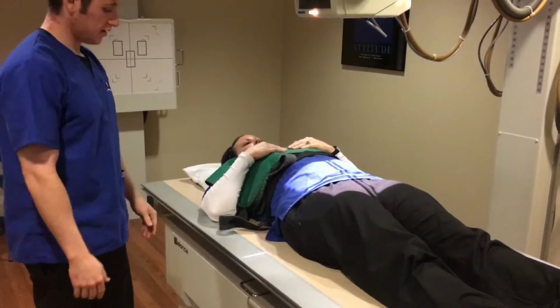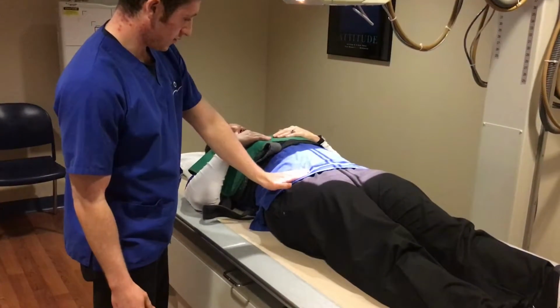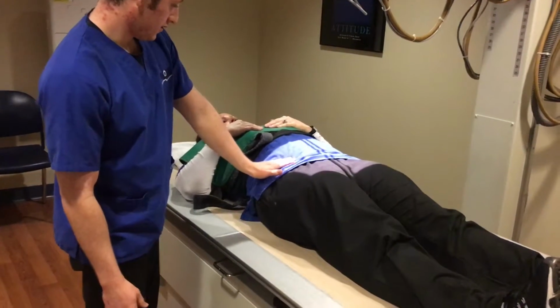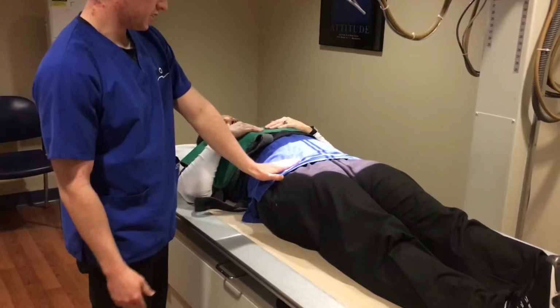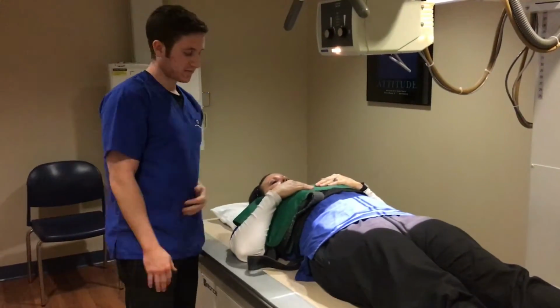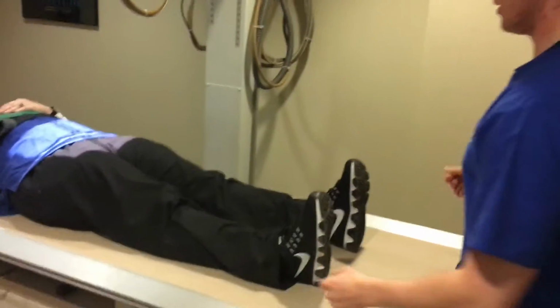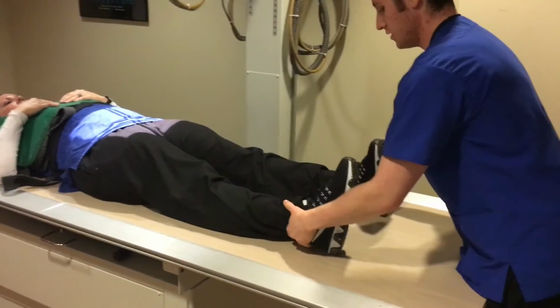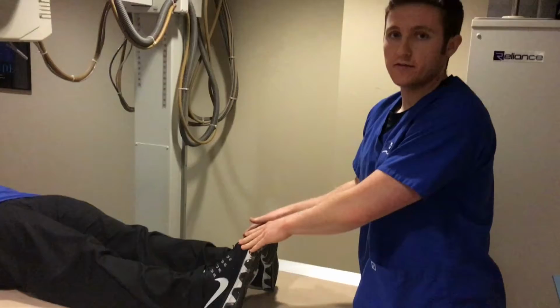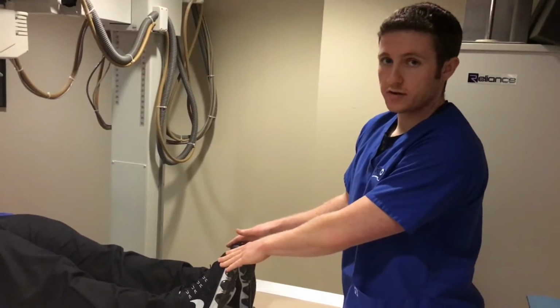As far as alignment goes, I want to be 2 inches inferior to the ASIS, or midway between the central pubis and ASIS. So I'm at 2 inches right there, and we're centered to the mid-sagittal plane. It's important for this projection to bring their lower limbs apart and rotate their feet and legs inward 15 to 20 degrees. This is going to demonstrate the femoral necks in profile. If we don't do this, the femoral necks will be foreshortened.